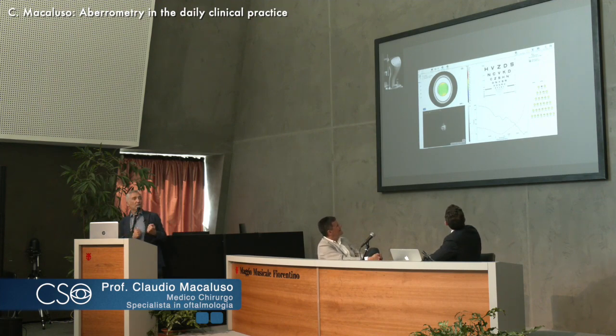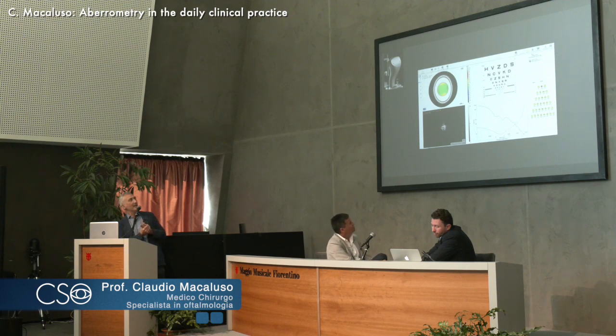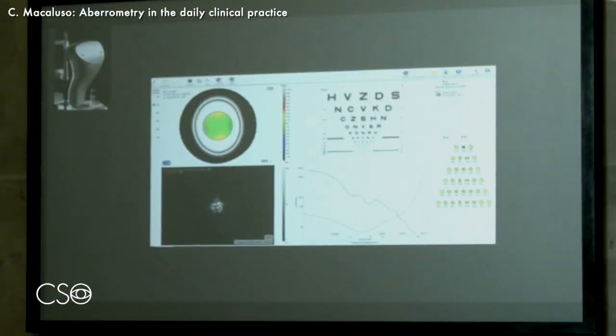If we, on the other hand, cancel just the spherical error, things are better. The astigmatism is remaining. Looking at the PSF, in which part of the Sturm's conoid do you think we are staying right now? We are just in the middle. It's the least confusion area of the Sturm's conoid.